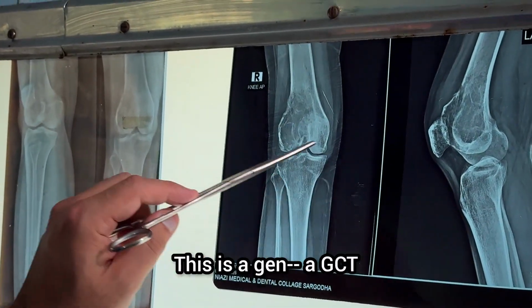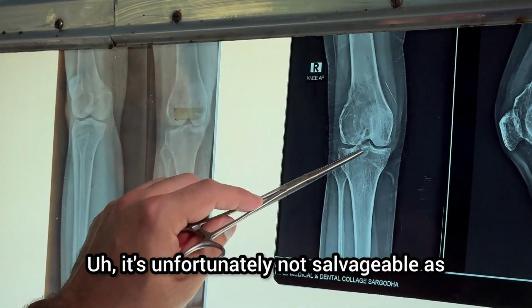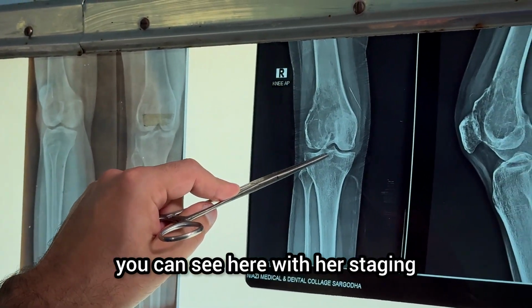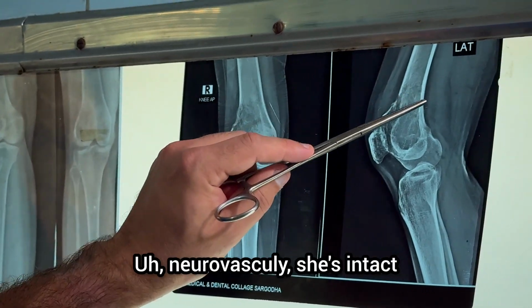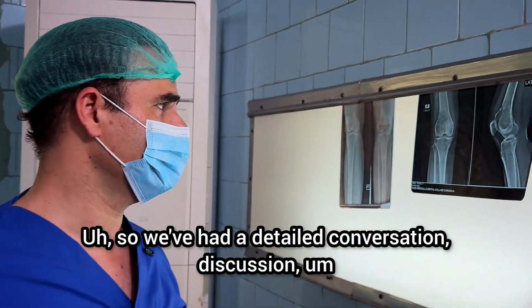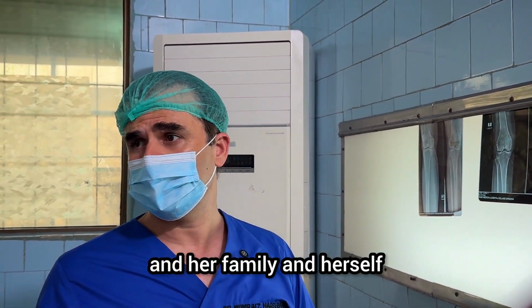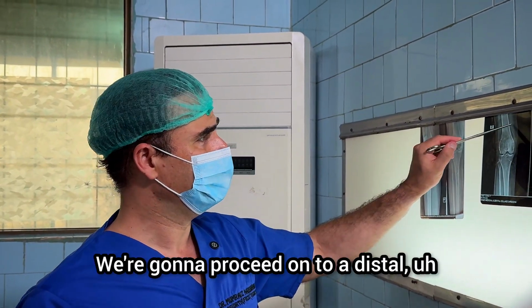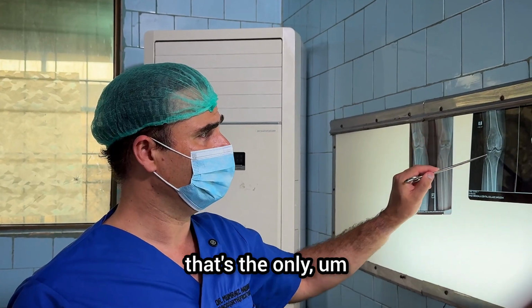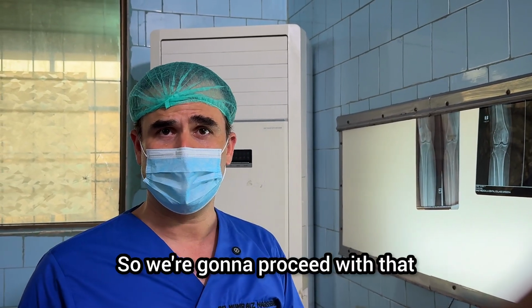This is a GCT. It's unfortunately not salvageable, as you can see here with her staging. Neurovascularly, she's intact. So we've had a detailed discussion amongst our team and her family and herself. So we're going to proceed on to a distal femur replacement here, because I think that's the only option we have available for salvage. So we're going to proceed with that.